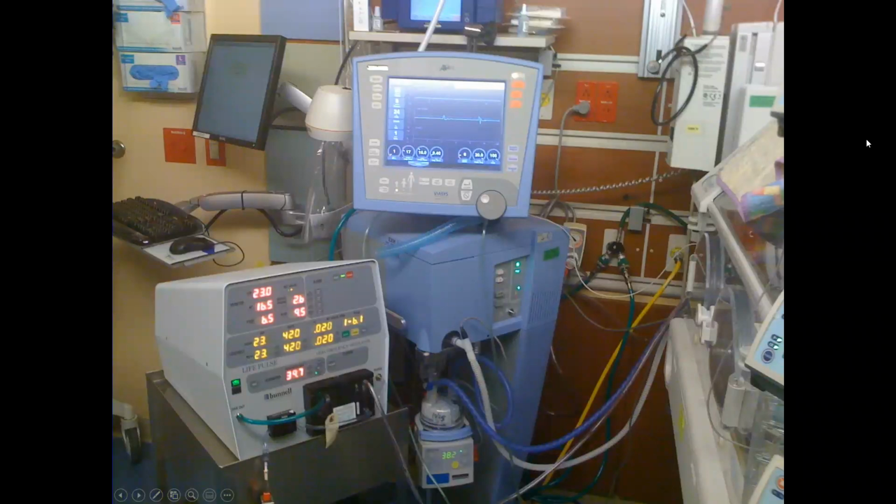All right, so this is a neonate's bedside. You have your jet ventilator. This is the older model. And then you have the Avea ventilator. So the Avea ventilator is going to give a breath once in a while. Here it's like 1 breath every minute. It's like a sigh breath. A little pressure with that. You're delivering your FiO2 and you're delivering some PEEP. So you have to have 2 ventilators set up with this.